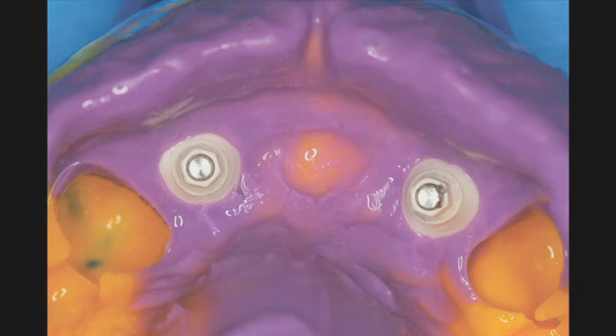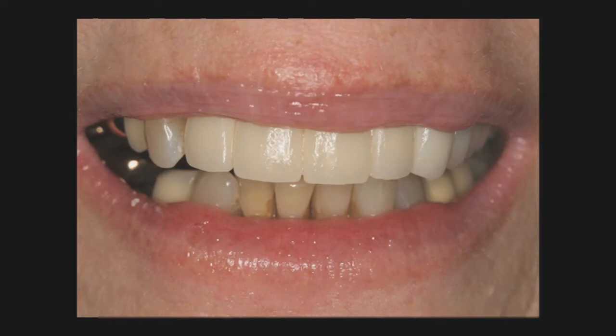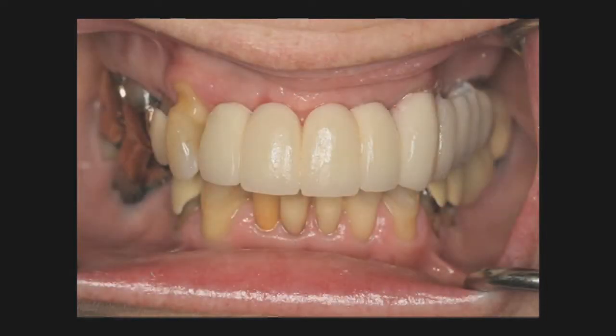Now, the laboratory was kind enough, because we knew we'd have some aesthetic concerns, to determine that the maxillary old bridge needed to be removed. So while they were fabricating the immediately placed bridge number 7 through 10, I asked them to create a temporary bridge number 11 through 14, maxillary left cuspid all the way to the molar area, to be seated at the time of delivery of the maxillary anterior bridge.